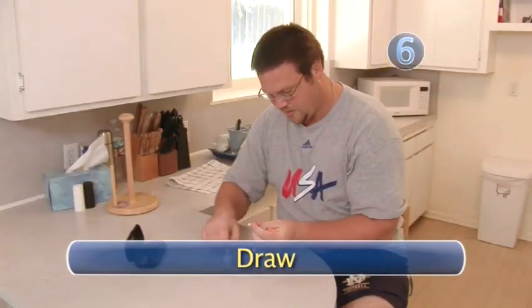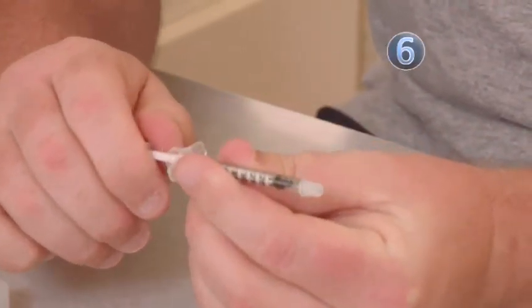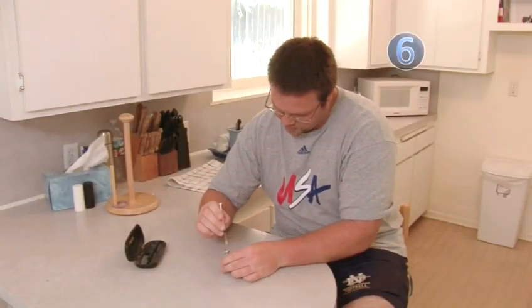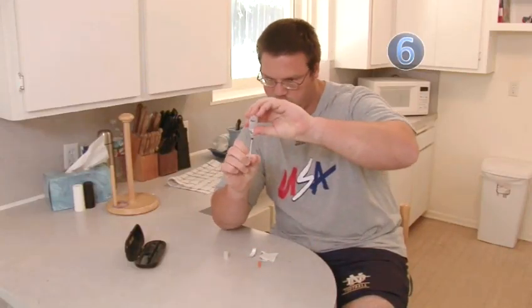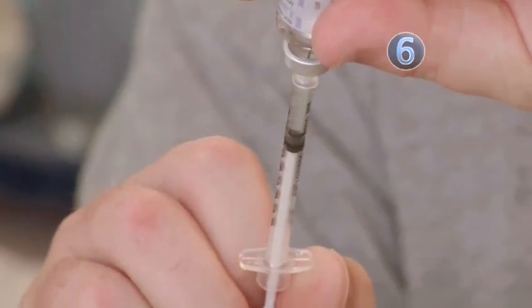Step 6: Draw. Remove the cap from the needle. Pull back the plunger on the syringe to draw in enough air to equal your insulin dose. Push the needle into the bottle top and inject the air into the bottle. Turn the bottle and syringe upside down, then pull the plunger to withdraw the correct insulin dose into the syringe.